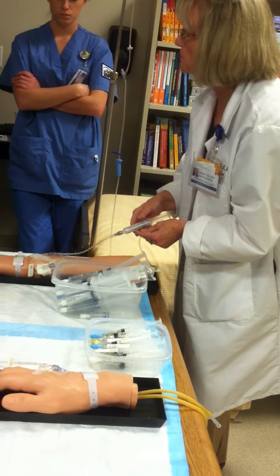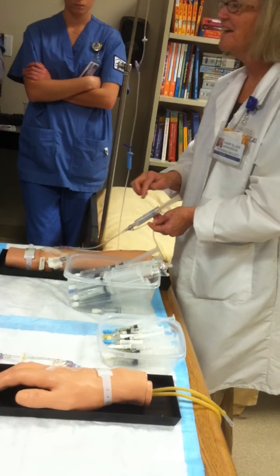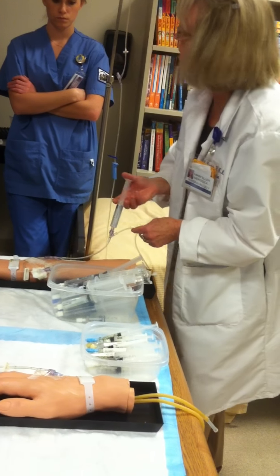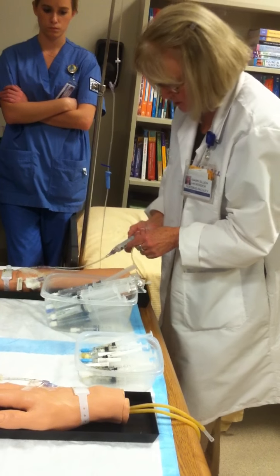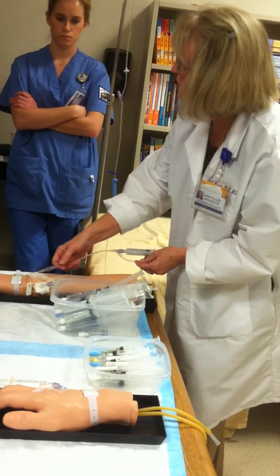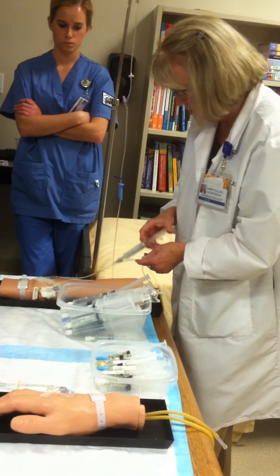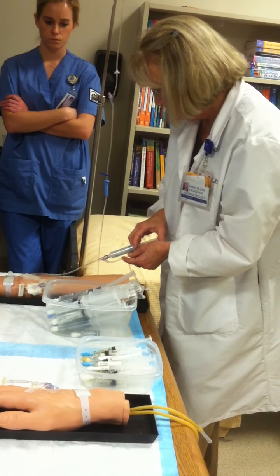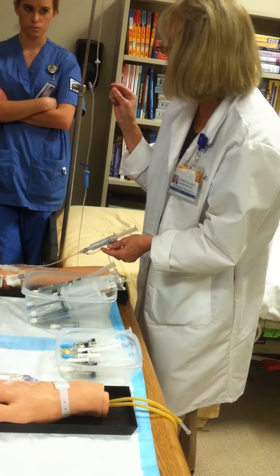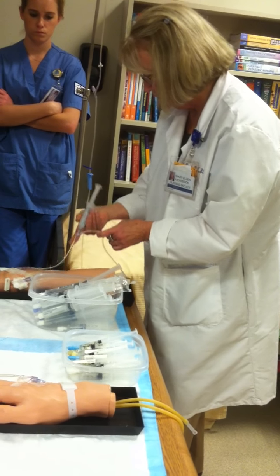You would have done that calculation, right? You'll always want to know the rate, especially with an IV. With a larger syringe there's less pressure, so some people like to dilute the medication — particularly with a very small amount — if it's possible to dilute it in a larger volume or to give it in a larger syringe.